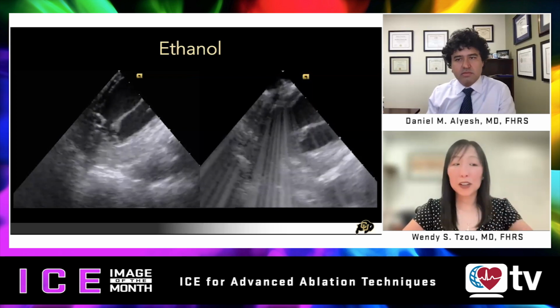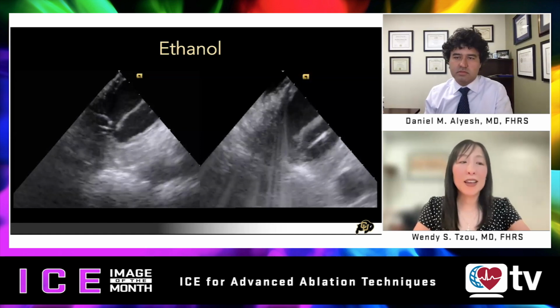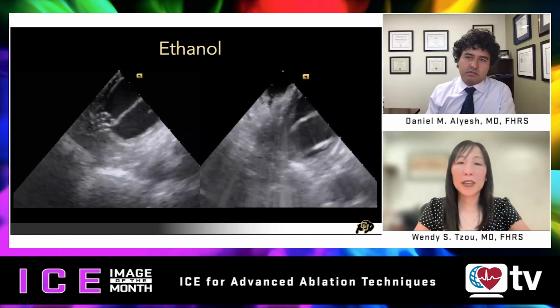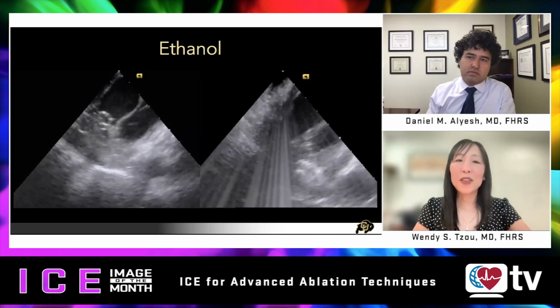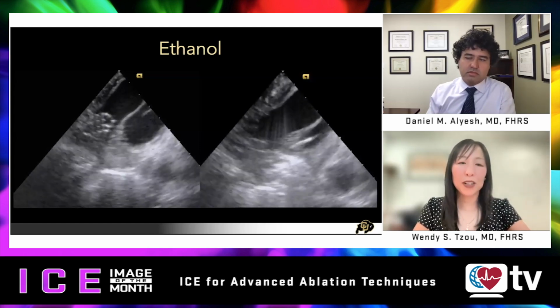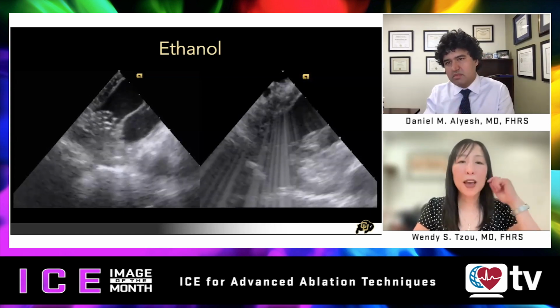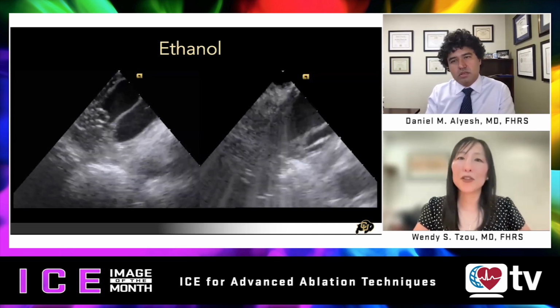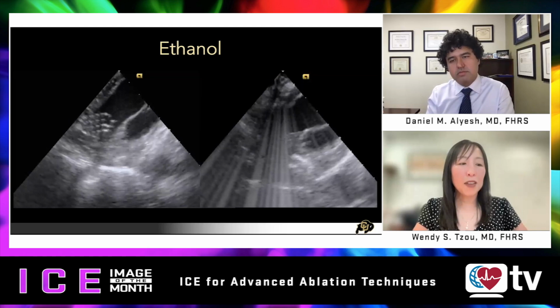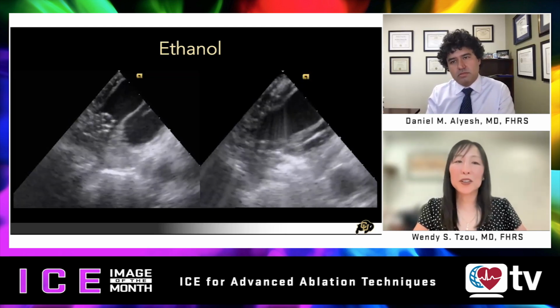Yeah, absolutely. Before we got to this point, we started with all the tools that we had, and that included RF applications in various formats. I used to do that. Once I became frustrated, I thought, okay, we should go with high power, long duration right away. What I found is that I often got steam pops because of the absence of the tissue priming effect, I guess.